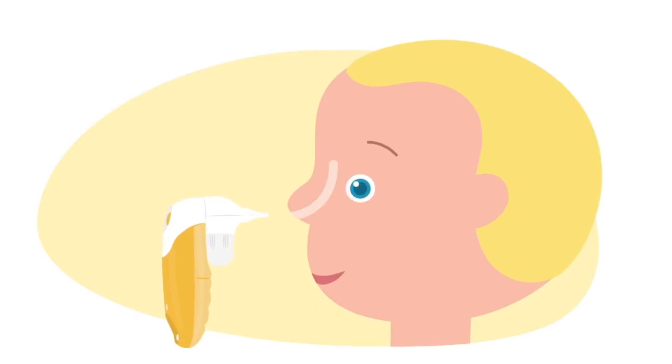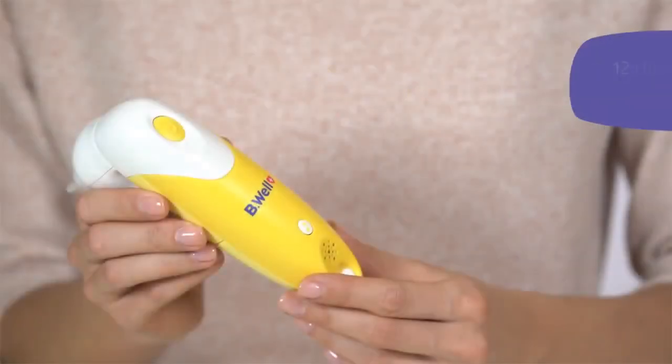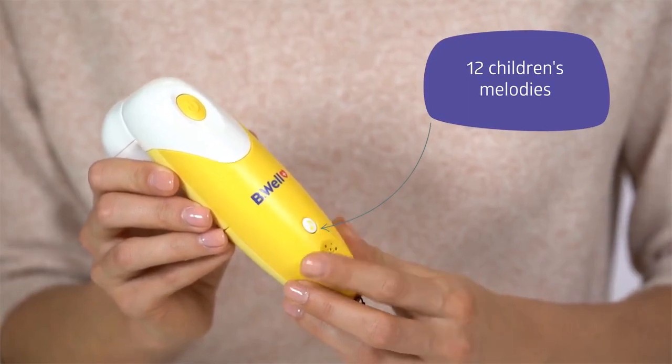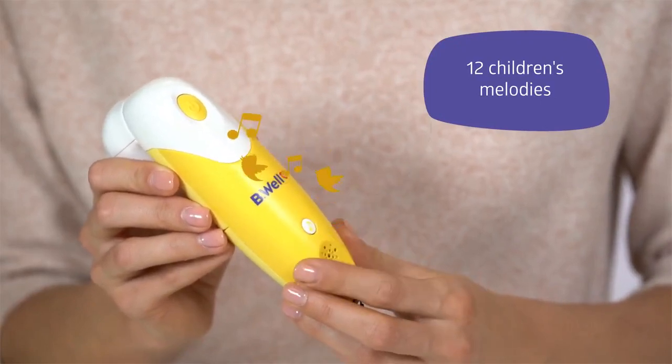The automatic device will prevent the spread of infection and maintain mother's health. The device has 12 children's melodies in its memory for the comfort of the baby. Press the special button and the device will play jolly music.